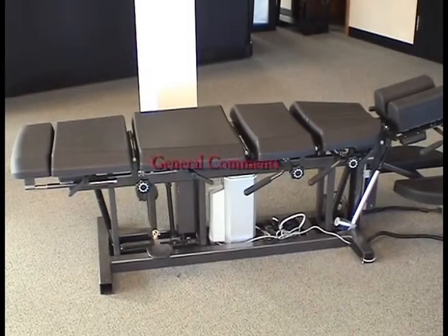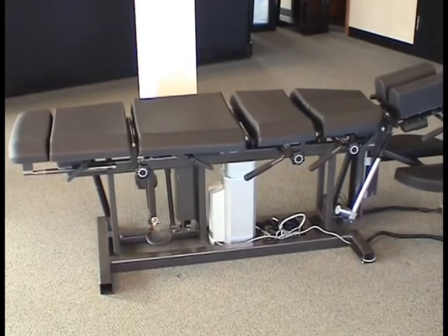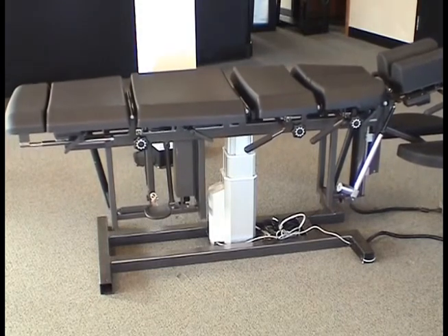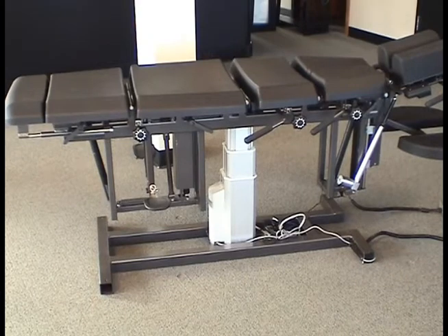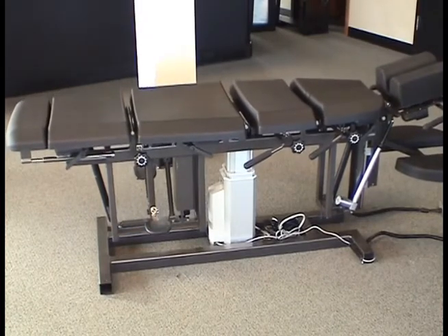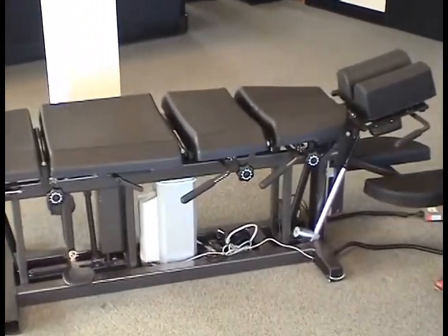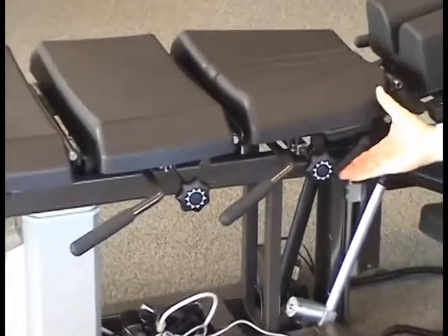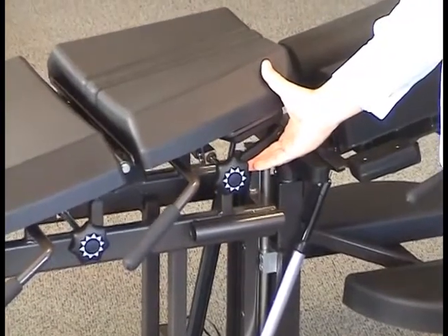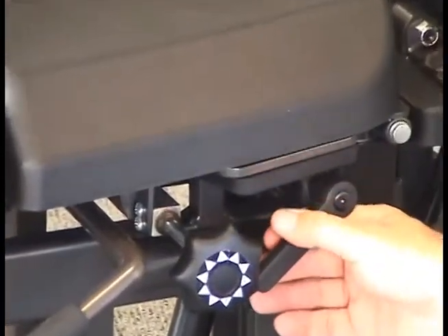General comments. If your table is equipped with an electric elevation motor, it can be raised to a maximum height of 29½ inches off the floor when the frame of the table is flush to the floor. The black plastic cylinder release levers operate every section of the table and are bilateral except for the headpiece, which has only a single lever on the right side. When the lever is depressed upward, it releases a gas cylinder to quietly and smoothly raise, lower, or angle and lock any section of the table.